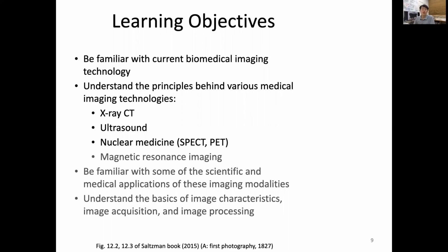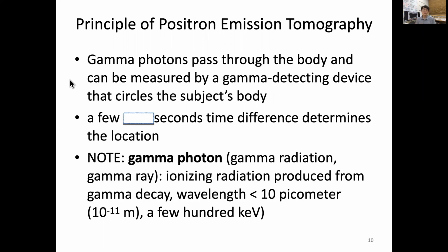Hi, now let's discuss nuclear medicine imaging, especially PET. So, the principle of positron emission tomography.